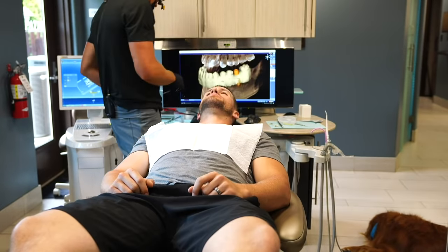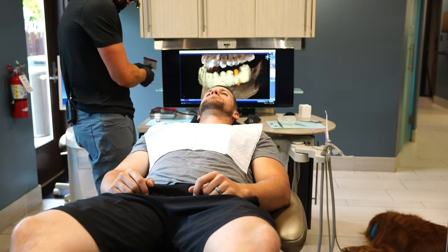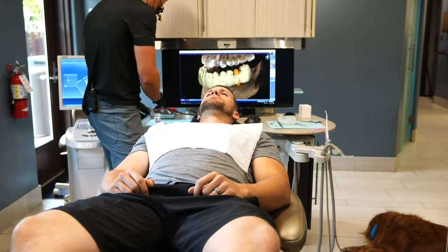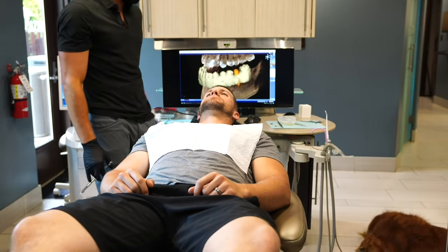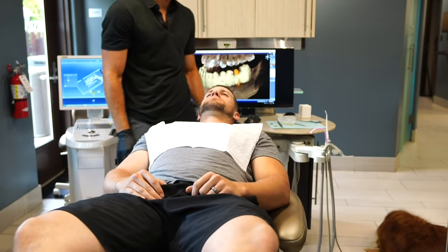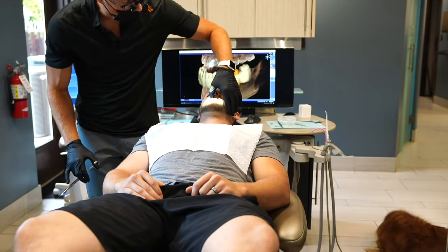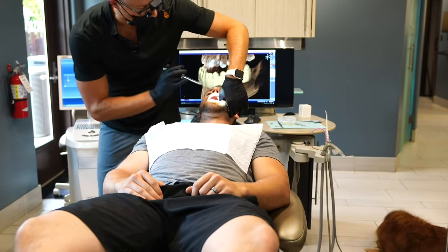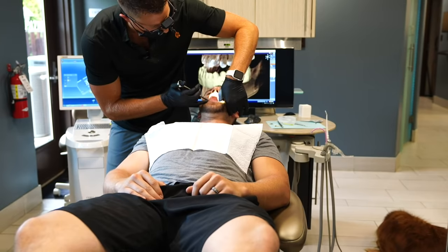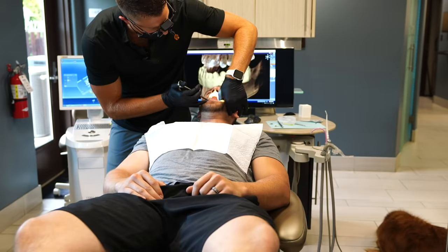You don't have to, but there wouldn't be a real function or benefit to doing just one, because obviously they wouldn't be working together to give you support. So I couldn't really see a reason other than maybe financially doing one this year or one next year, that type of thing. Now, the benefit we have with patient funding is we can usually get funds to help people get them. Go ahead and open real big there for me. To place them a little bit more frequently and pay over time.